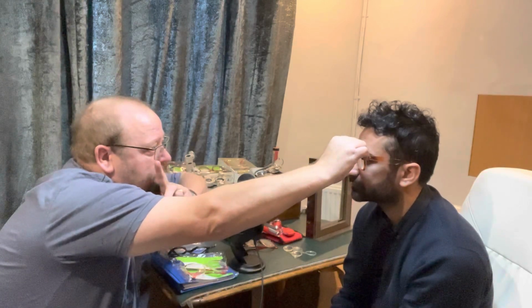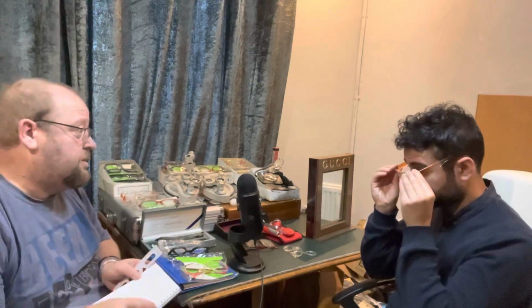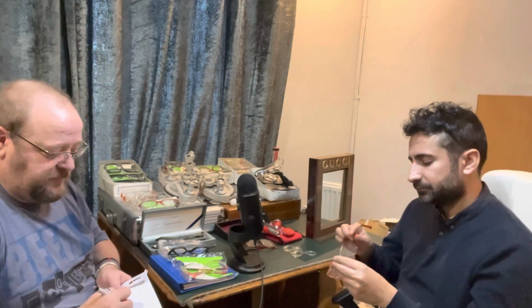and then across. Thank you. I don't need to measure heights because we're not doing a bifocal. And did you want the G15 so it mimics the Ray-Ban perfectly? The tint? Yeah. Yeah, please. It's full UV blocking. Is that right? Yeah, it gives 100% UV protection. So it's UV 400, G15.